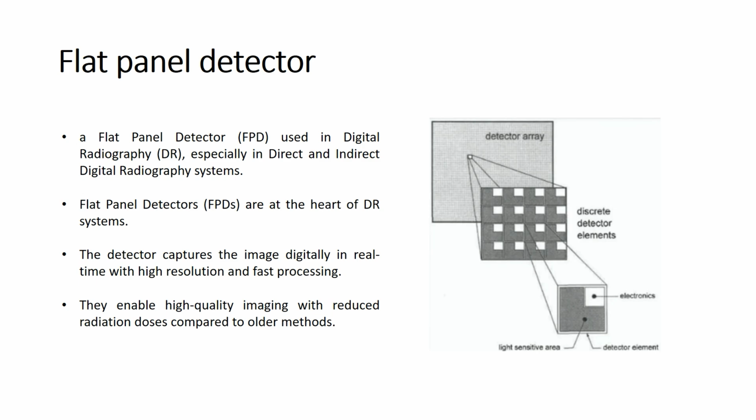The detectors capture the image digitally in real time with high resolution and fast processing, so that they enable high quality imaging with reduced radiation doses compared to the older method.